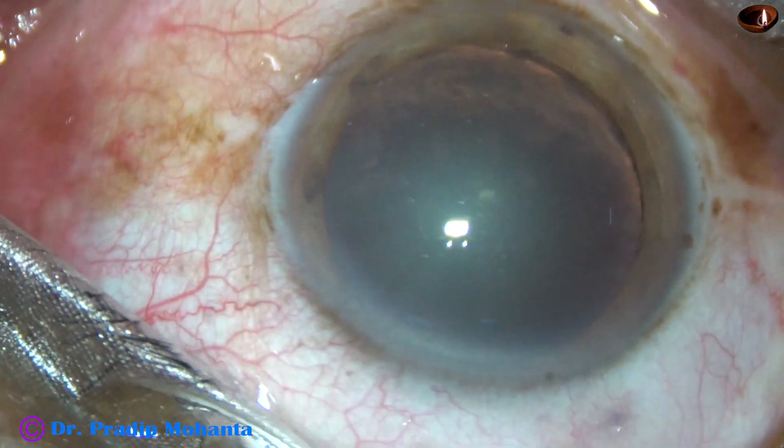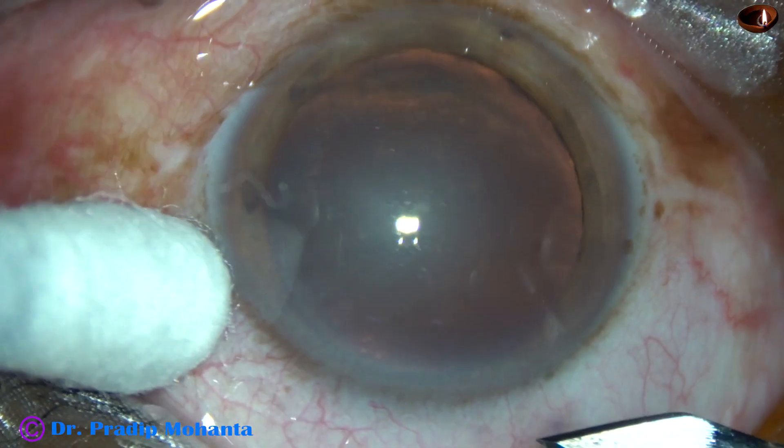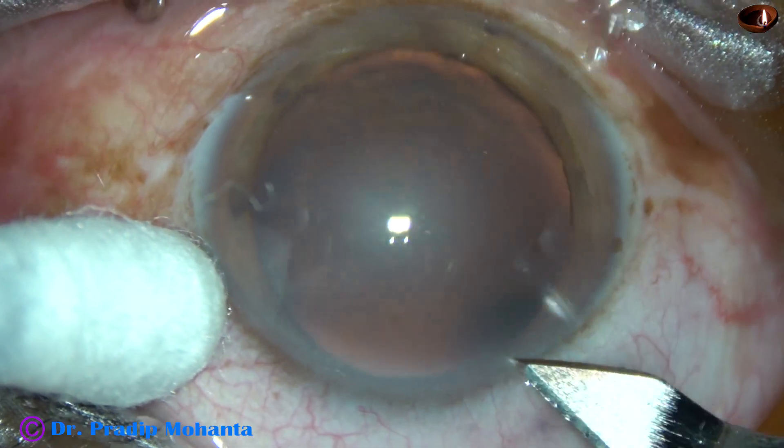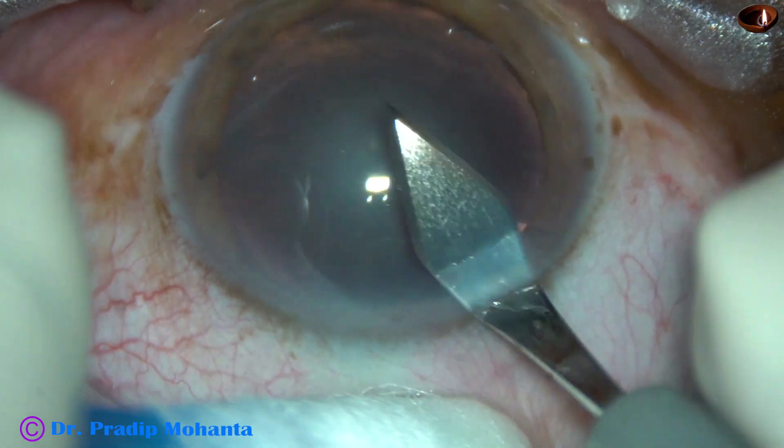In this video, I want to show my lens tilt technique for FACO of a soft cataract. This is the main incision with a 2.8 mm steel keratome.